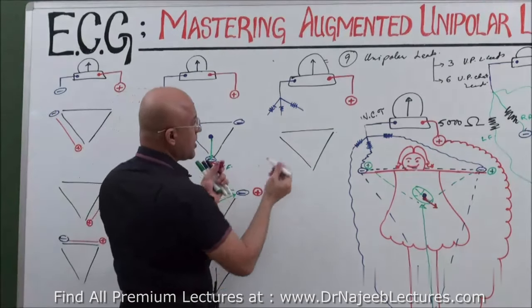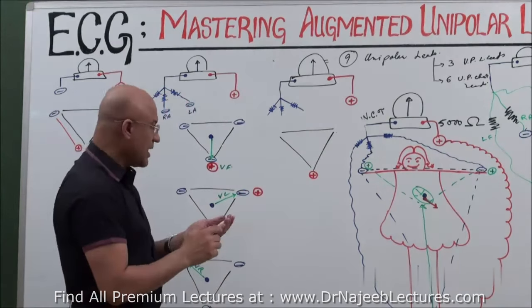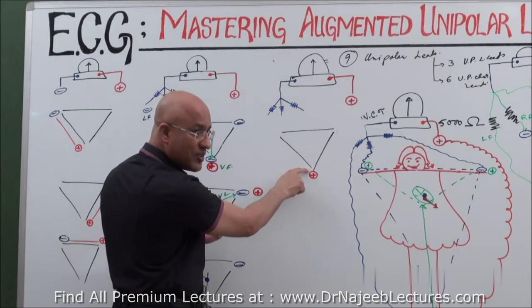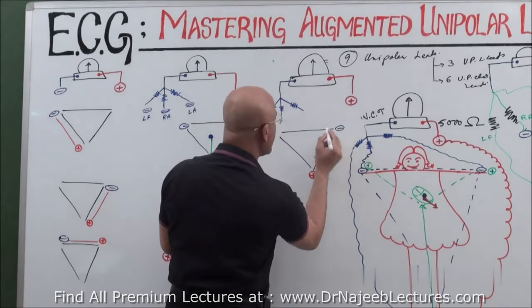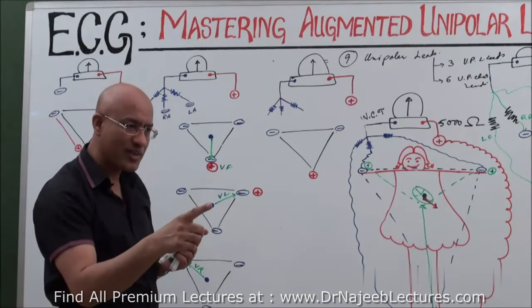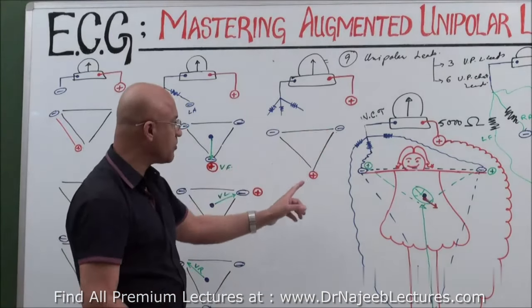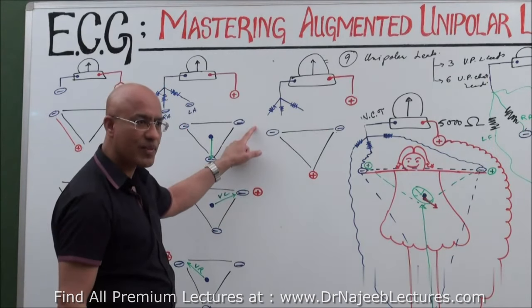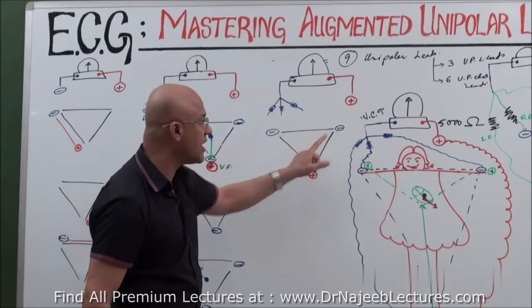For example, if Goldberger was putting positive here, he disconnected from this limb, what? Negative. When he disconnected negative, now negative are left only? Right arm and the left arm. You understand it? Yes. Right arm and the left arm. Now you imagine back. If positive is here and negative is only here, what is this lead? Second lead. If positive is here and negative is only there, what is this? Third.